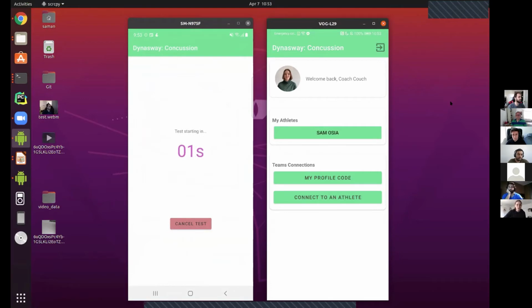All right, well, we know that this is tracking center of mass, but Enrique, how is it doing that? Well, it's good that you asked. So remember how the instructions said that you should place your cell phone on your waistband? This is because we're using the phone's accelerometer to measure center of mass sway. And thus, if you place your phone as close to your waistband as possible, that is the closest you can get to a person's center of mass. That's why we're doing this.